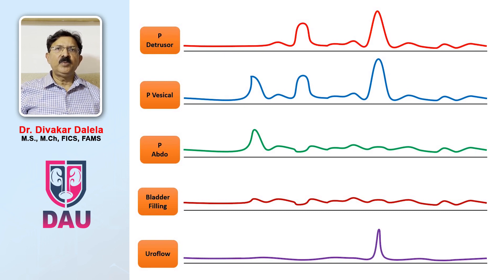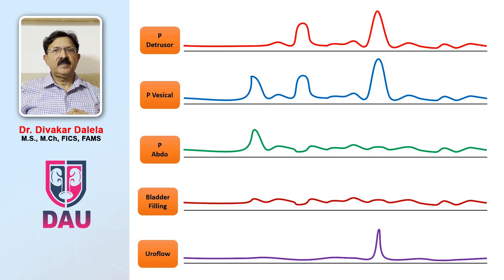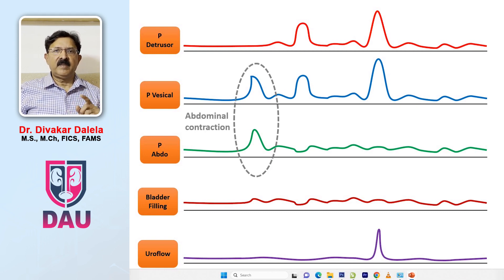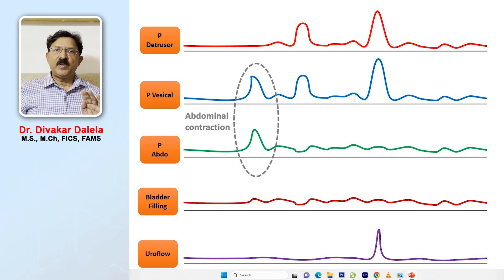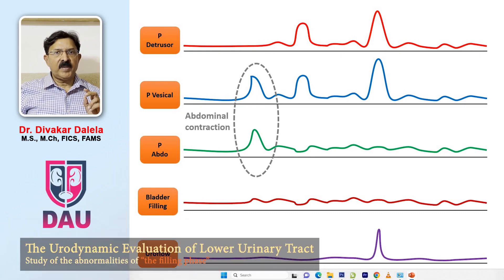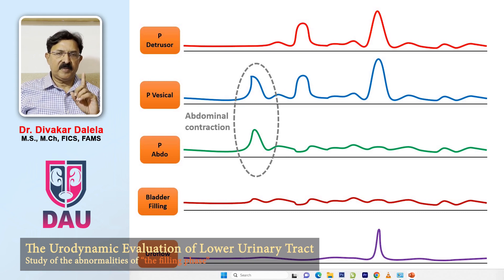Now let me explain these three elevations that you notice in these pressure lines. In the first elevation, you would notice that there is a rise in P-abdomen and a rise in P-vesicle, but P-detrusor does not show any change. This is checking the lines by the cough caused by the patient. When the patient coughs, the intra-abdominal pressure rises and so does P-vesicle. But since the detrusor muscle is not contracting, it will remain quiet. So this is the first elevation.